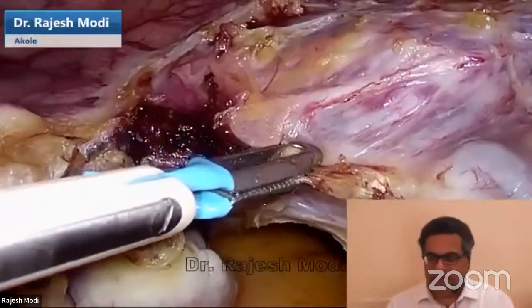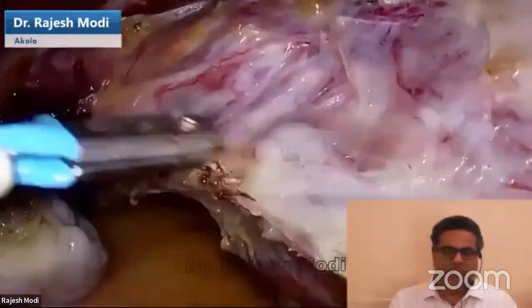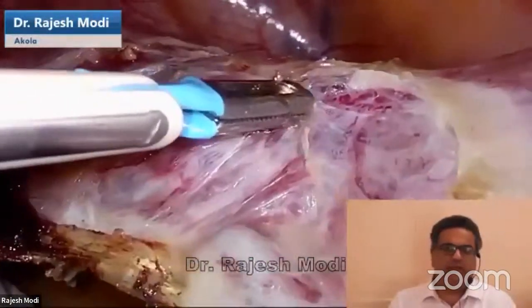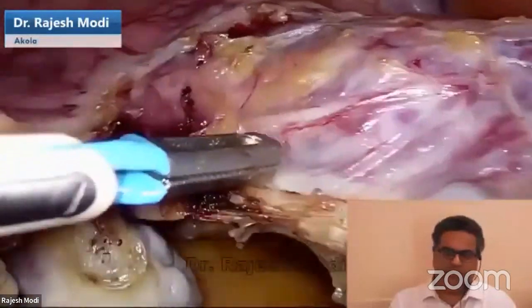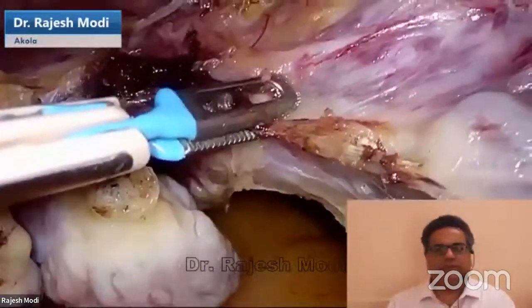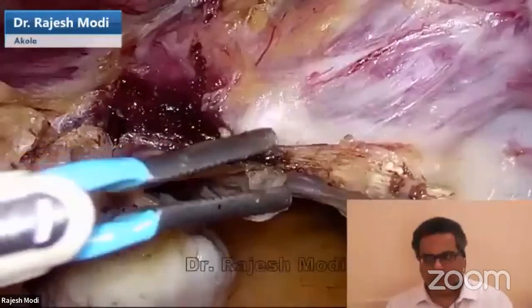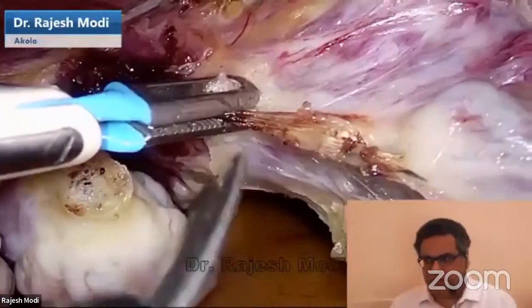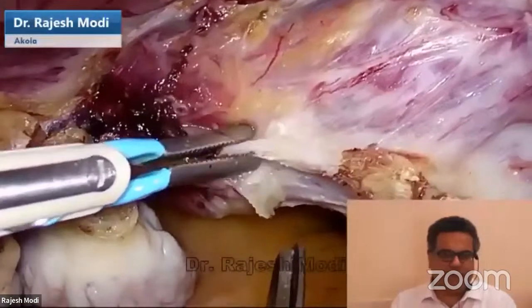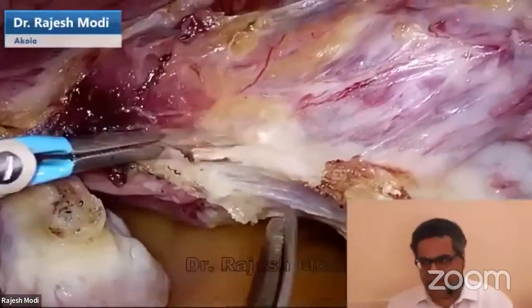And then you have a segment of the uterine from the place where the UV fold has been cut, which you can see is a knuckle part, and maybe 1 or 2 centimeters lower down. So this much segment of the uterine is available to be coagulated and cut. When you are coagulating and cutting in this particular area, the ureter is far, far away. You really do not have to worry about causing ureteric injury at this junction.